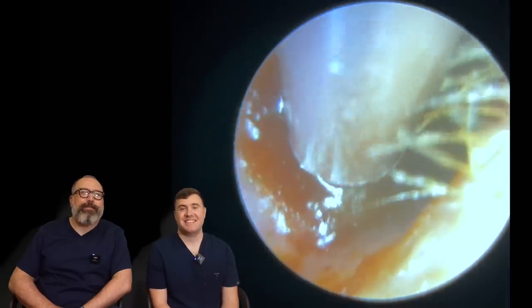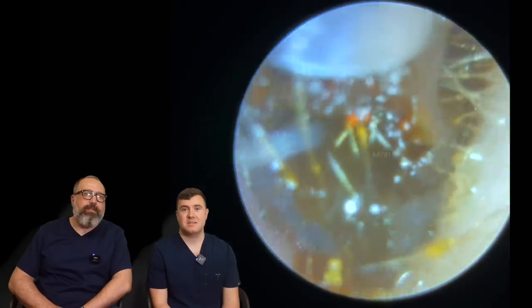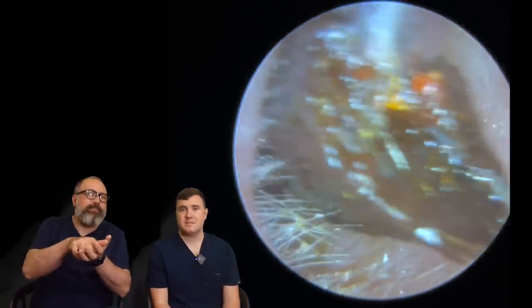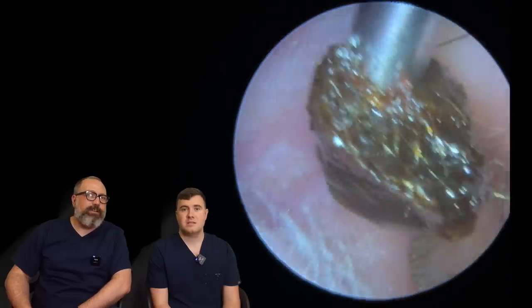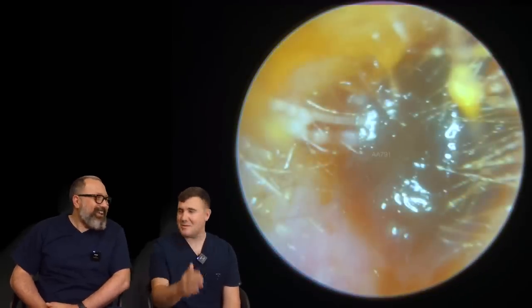So we've got four patients in this compilation video, there's loads for you to watch. This first patient is my patient. You can see lots of olive oil in here straight away, very, very soft. Just drone everything forward — it's great when it does that. Sometimes you'll get a little bit of skin that'll attach to the entrance and back into the wax plug as well. Very, very thick plug sitting in that ear canal. Look how easy that was — done. I wish everyone was like that.